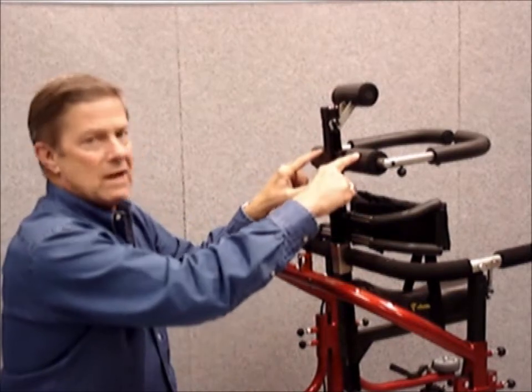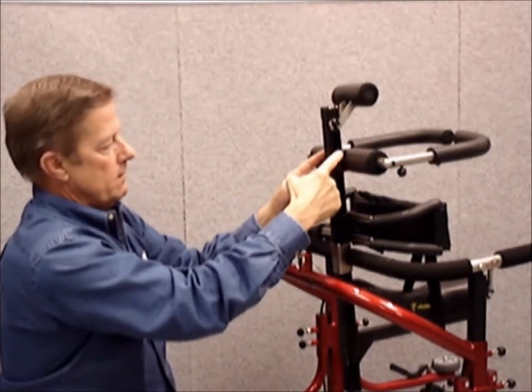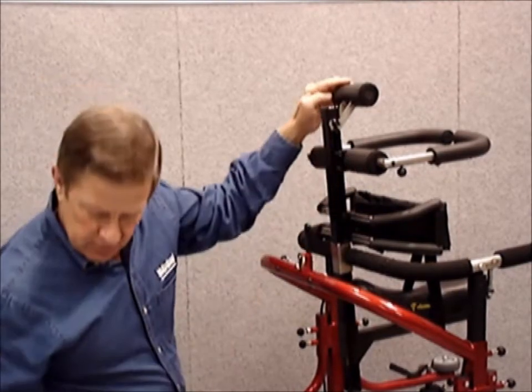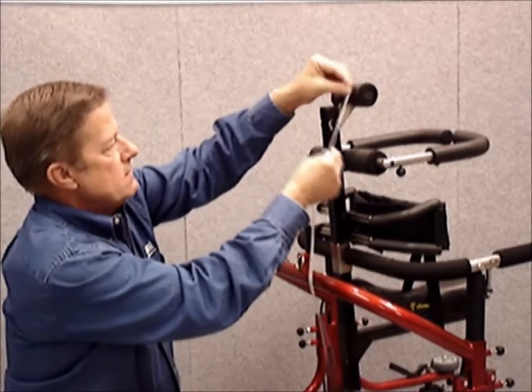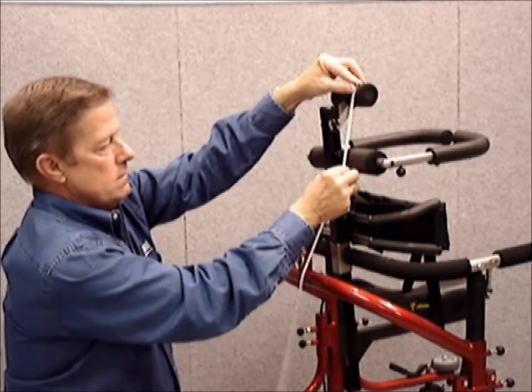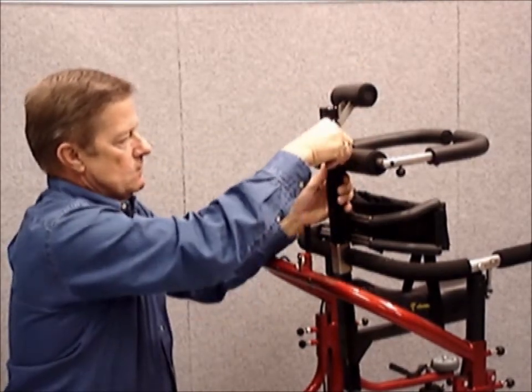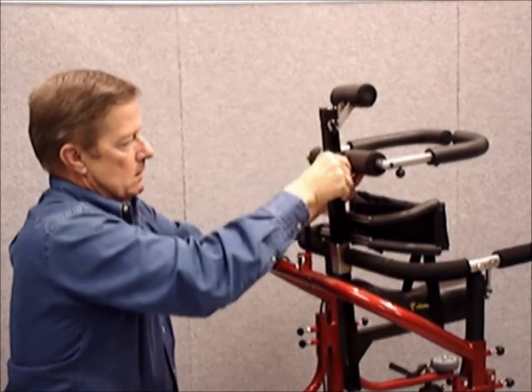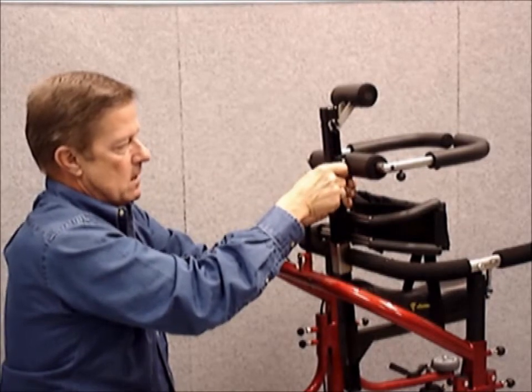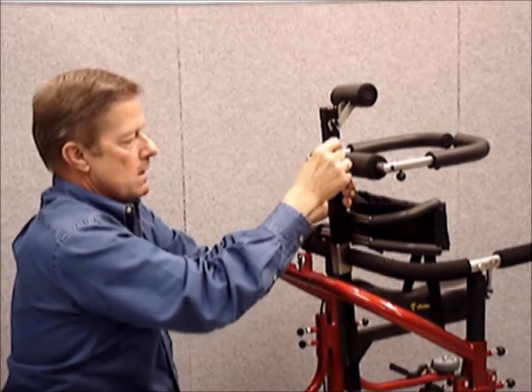Next, adjust the thoracic ring. This is accomplished by loosening the 4 screws, 2 on each side of the front section of the thoracic ring. There should be approximately 5 to 7 inches of room from the top of the sternum pad to the thoracic pad. Loosening the 4 screws will allow you to lower or raise the thoracic ring to your desired height. Make sure then that you tighten and secure all 4 Allen screws.